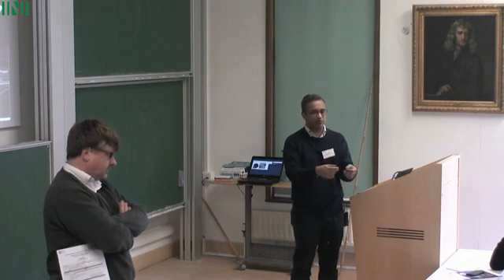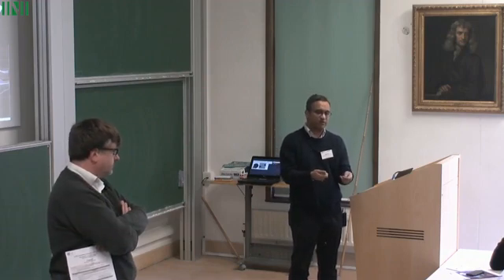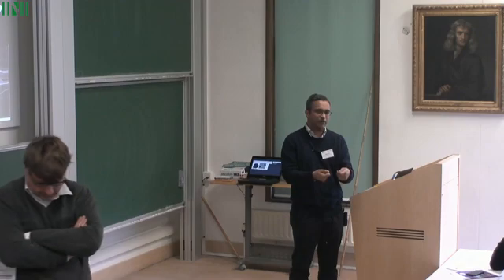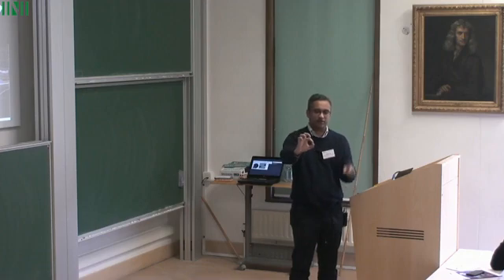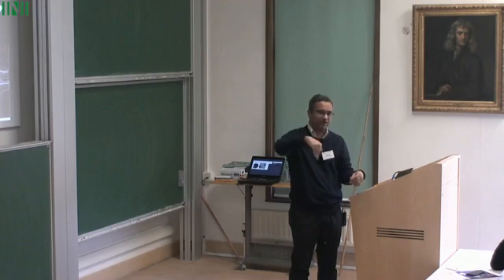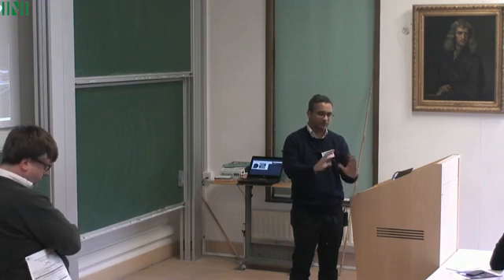So for example, if someone was to say, here's where the prostate is, and then we applied the algorithm, then presumably the algorithm would have more confidence with respect to the classification task, as opposed to saying, here's the prostate, and here are like 6 million voxels surrounding it. So what's happening in every layer is that we are amplifying the signal by restricting the area of interest.